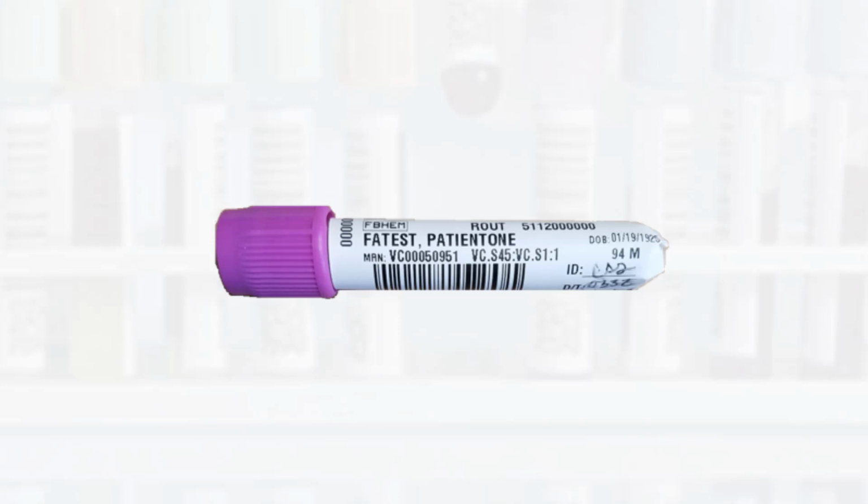Place the label on the tube under the stopper. Make sure that the order number is at the top of the tube and the label is straight on the tube, as you see in our example. This will allow a much smoother process for the person responsible for scanning the samples with a barcode reader, and for the lab staff as well, since the instruments in the lab also use barcode readers.